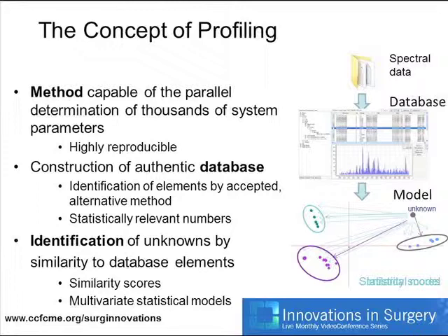Okay, that's great. So you can see that what you'll end up with is a spectral database which is validated against some histological data set. So every spectra that we take out of a patient we validate with histology. Then what you are able to do is to build a set of multivariate models based usually on a supervised and an unsupervised approach. We typically use principal components analysis, which is a projection-based method, or linear discriminant analysis. And when you then have an established model with an unknown in that data set, you can make a prediction as to what the original class of that spectra is likely to be.